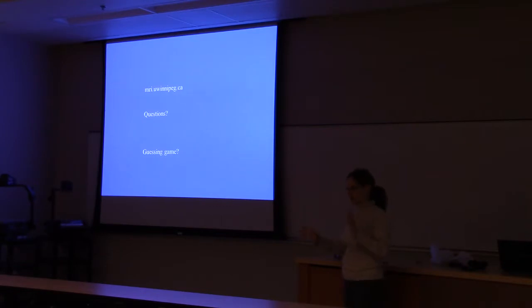So the 3D, mostly what it's used for in diffusion tensor imaging is that along the axon it's pretty free, so you get those high diffusions. Across the axon it's pretty small because it's restricted. So there's a big difference between along and across. And from that, if you put on enough directions, you can work out which way the axons go. So they can actually do tractography.